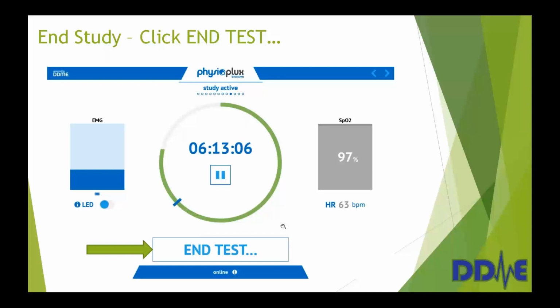It's going to generate a PDF report, and then it's either going to save it in the case where we're not connected to Wi-Fi. If the patient happened to connect to their home Wi-Fi, that's fine. They can optionally do that, and then the report will be sent. So it's kind of cool. It's conceivable that if they get up at 5:30 in the morning, you have a report in your inbox on email at 5:31, and you'll see exactly how the study went home for the patient.